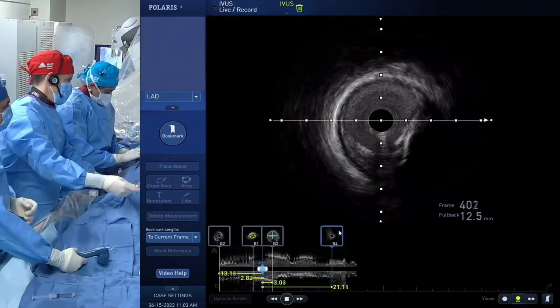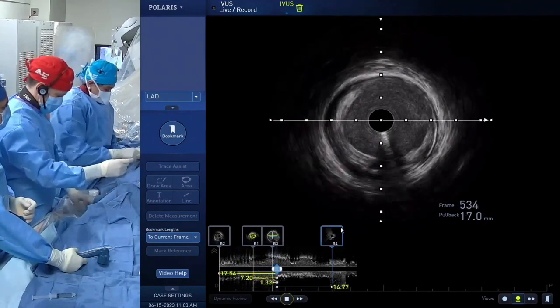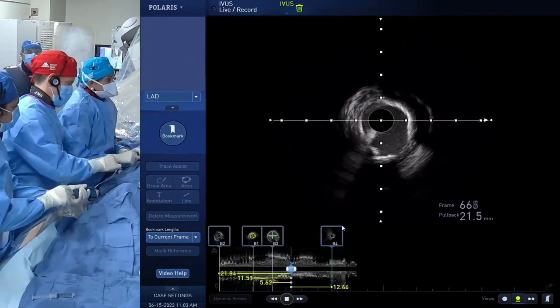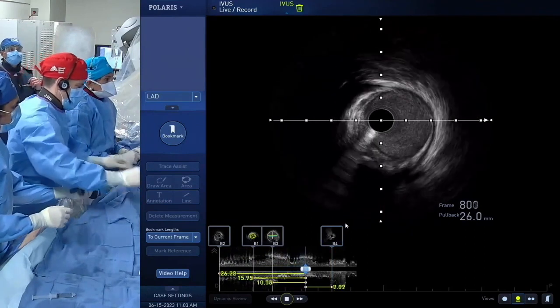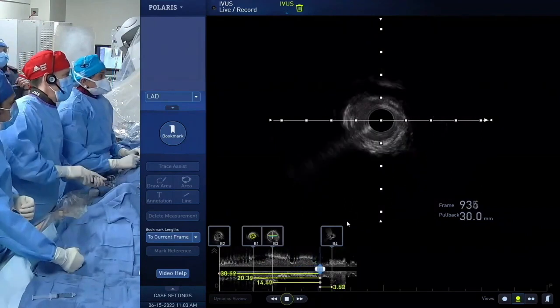Now we come to the proximal good healthy landing zone, like for low vessel, then lumen 3.5. And now a little bit of calcium, but mostly fibrous. Yeah, this is a little bit of calcium. And soon we come back to the eccentric fibrous plaque. And also some attenuation. This is all lipid plaque, not calcium.